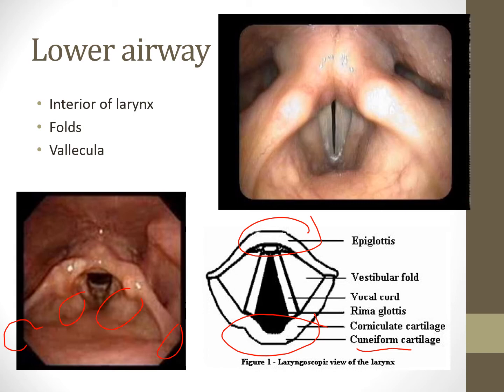The idea is when you intubate, you need to see the vocal cords. You need to identify them, no matter how swollen they are. You need to see what you're doing. Now, there's blind intubation. There are alternate airways where we don't need to see the cords, like an LMA, a laryngeal mask airway, or a King tube or a Combitube. There are other ways to do it blindly. Even nasal intubation can be blind as well. In other words, we don't need to see the vocal cords. We'll use other techniques, but we need to be able to identify these structures, especially if you're using video intubation skills.